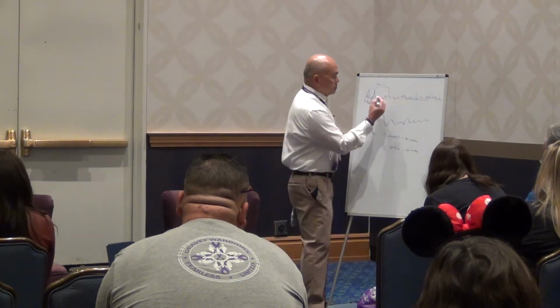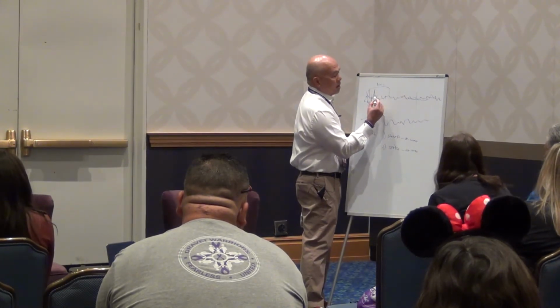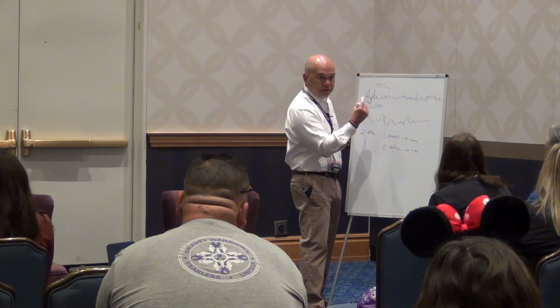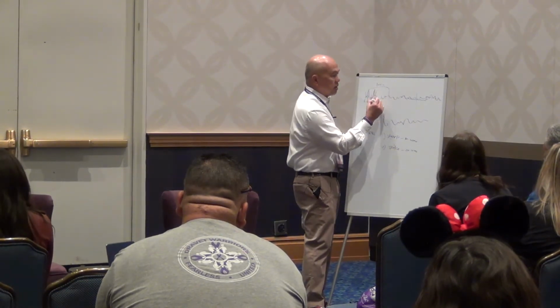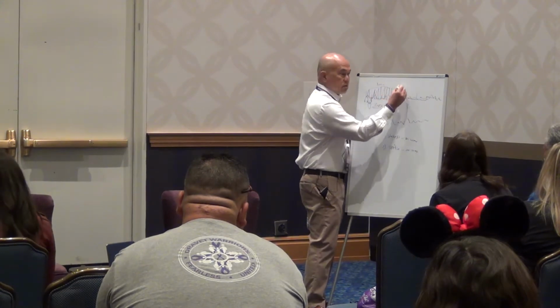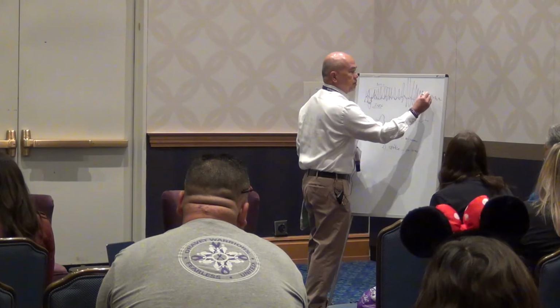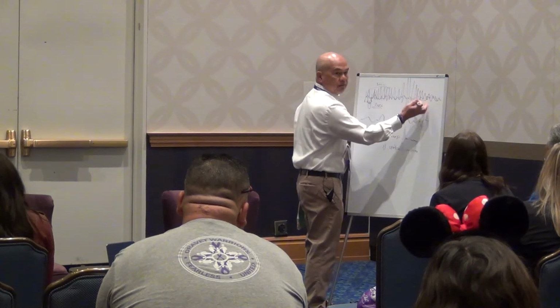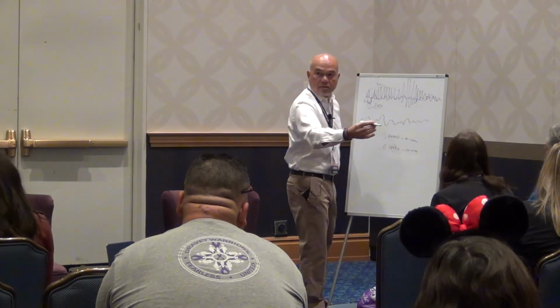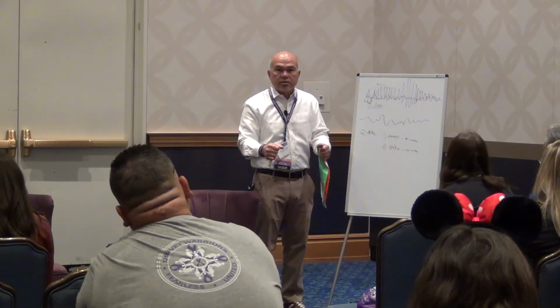So if someone is having seizures, the spikes are going to come one after another. So it's going to look like this. And then when the seizure is going to stop, the spikes come down in amplitude and then it slows down. So you see a person having generalized seizure, they start jerking like this.